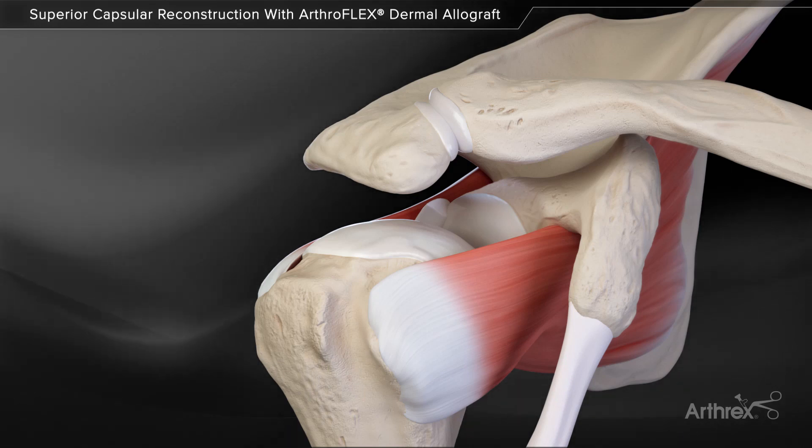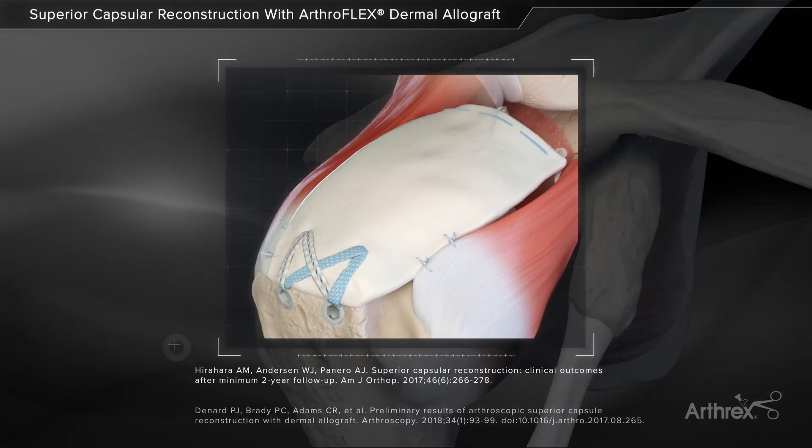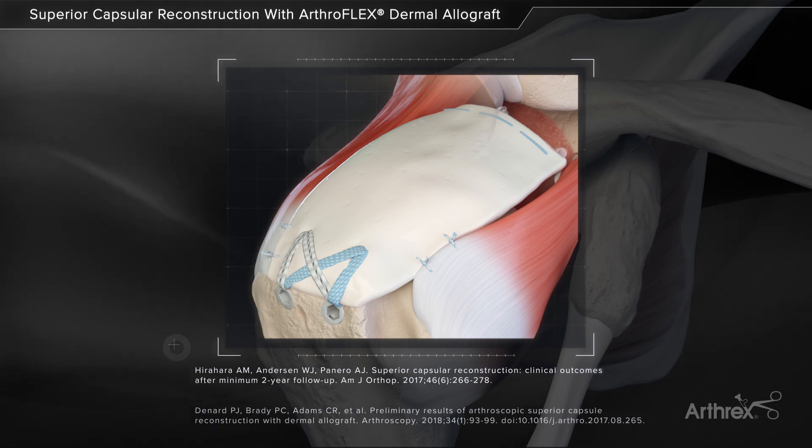Superior capsule reconstruction is a technique to address the massive irreparable rotator cuff tear using the ArthroFlex Dermal Allograft. In this technique, we'll span the superior glenoid and humeral tuberosity to help reduce superior translation and improve glenohumeral joint kinematics.